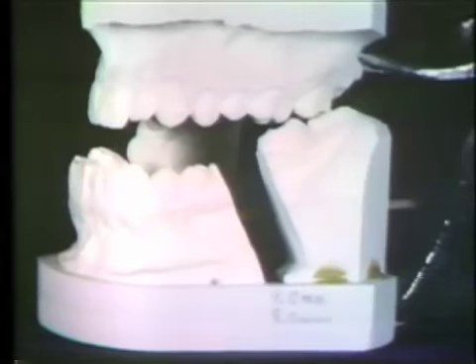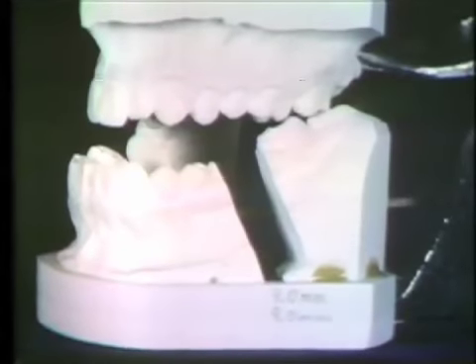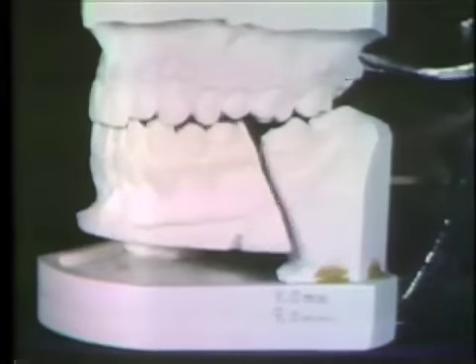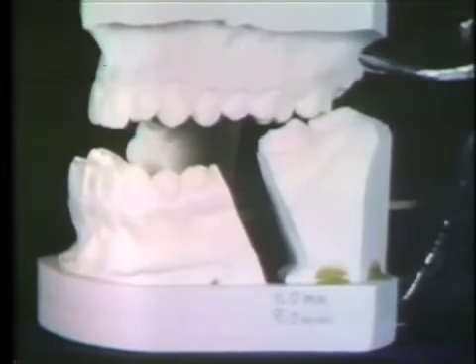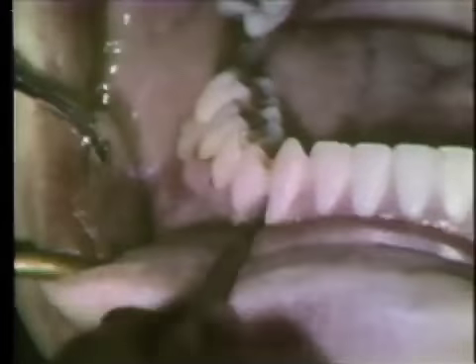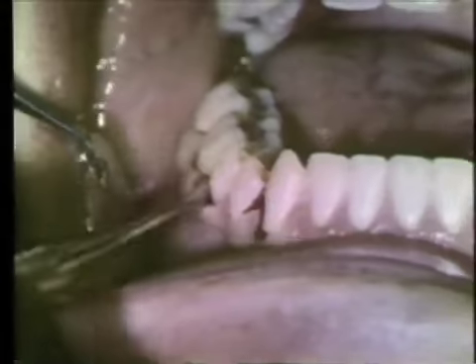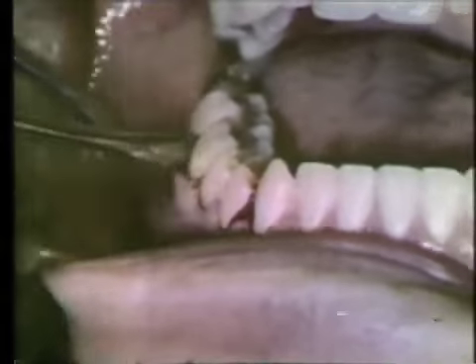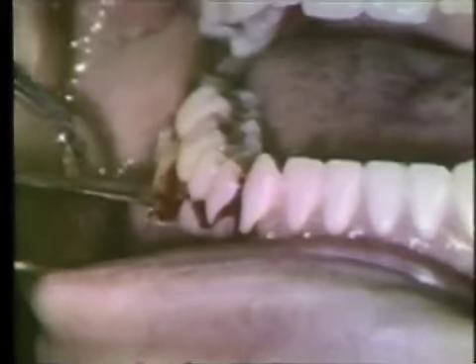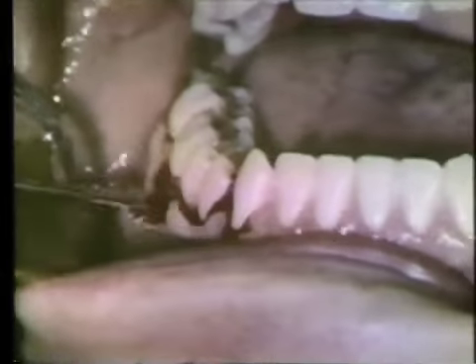There will be, along with this, an improvement in the facial profile, in the musculature around the mouth, and in the tongue relationship. So this would be the manner in which the segment of bone will be removed in this operation, which we have termed an ostectomy because there will be removal of bone. In contrast to the term osteotomy that we'll see later, in which just infers that the bone is cut, but no quantity of bone is removed.